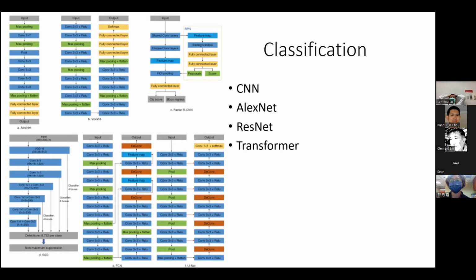Thank you, Dr. Lin. The first question is about the ROI. We're trying to use a 3D image, so our ROI is a 3D patch image. That means we will cut the 3D image into different patches, like blocks, to fit into the computer. And actually, we have some pre-formed architectures like 3D UNet or 3D ResNet. For this kind of architecture, we only feed in the CBCT image data, and it will rescale or resize the image for us to do the further computation.